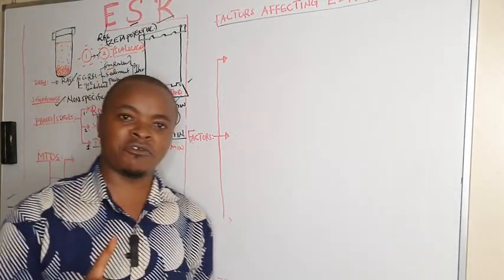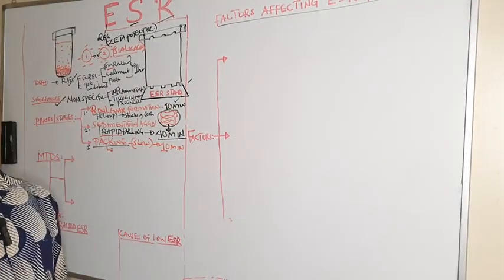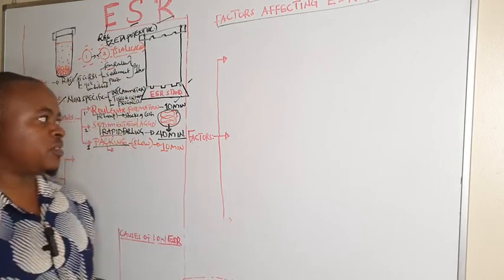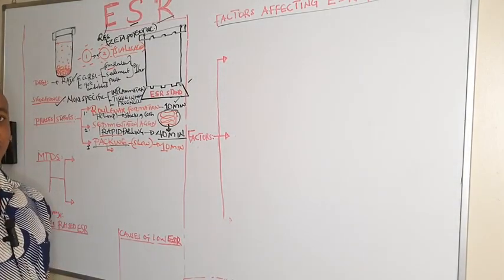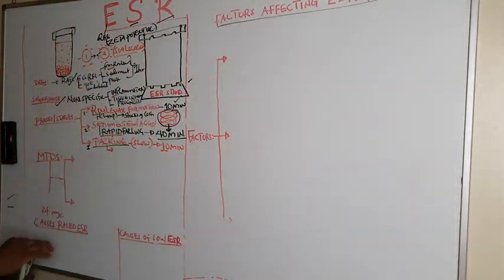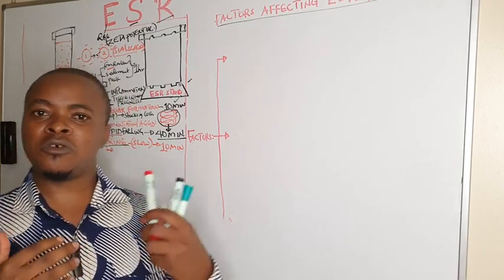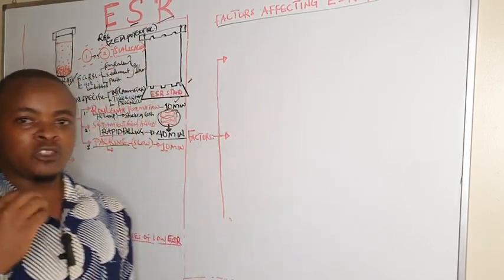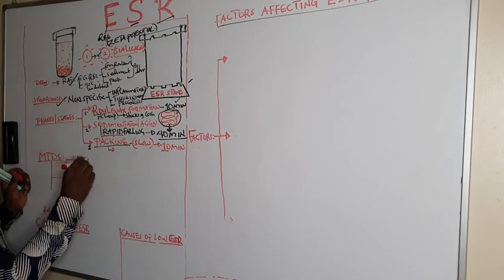So stage one, Rouleaux formation, for 10 minutes. Step number two, sedimentation or aggregation, that is 40 minutes. Then number three is packing, which is a slow process and also takes 10 minutes, making a total of 1 hour. So after looking at the stages, now we want to see what methods lab technicians, technologists or assistants use to determine ESR in the lab. The most common manual method being used is Westergren. We have the Westergren method.